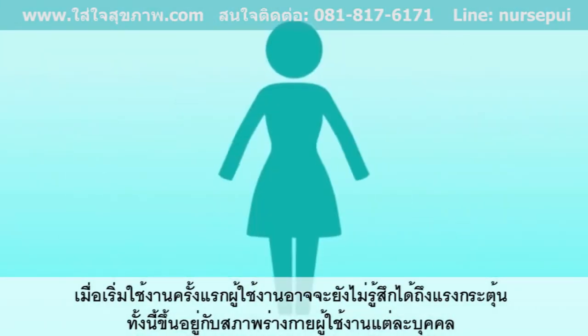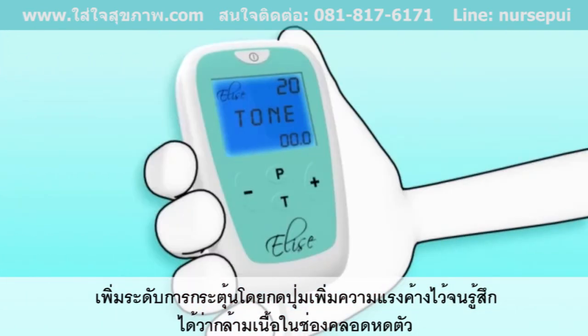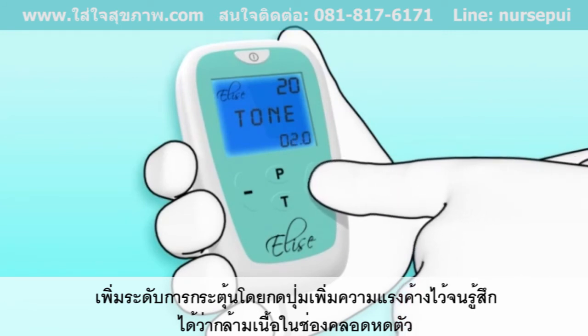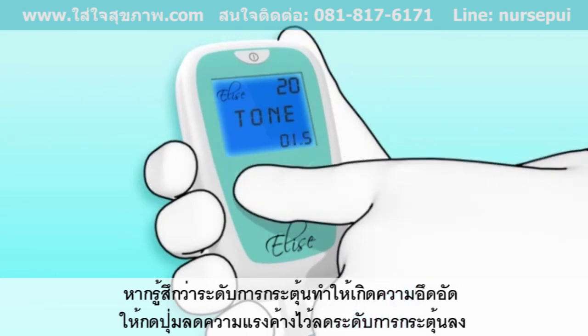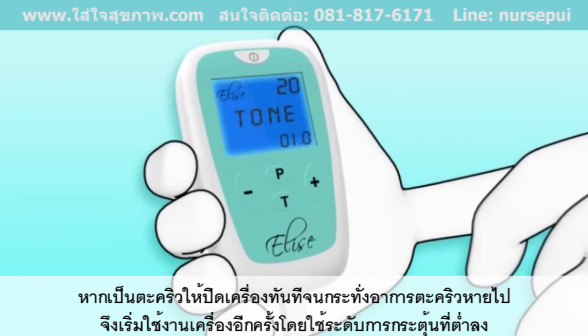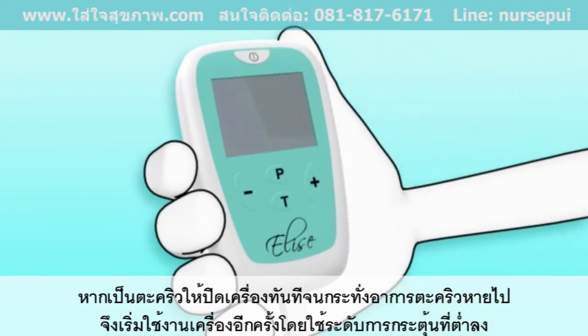To start with, you may not feel any sensation at all. This depends very much on the individual and any pre-existing physical conditions, so slowly increase the intensity by repeatedly pressing the Strength Up button until you begin to feel the muscles around your vagina contract. If this sensation becomes uncomfortable, reduce the intensity using the Strength Down button. If you experience cramping, switch the unit off until the symptoms go away, then continue the session with the intensity set at a lower level.